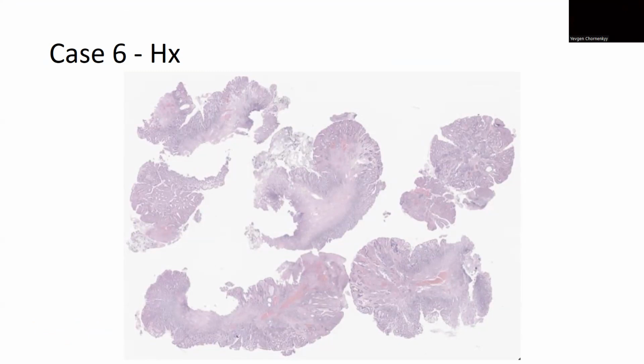I have a question for the resident. If you see columnar epithelium in the upper third of the esophagus, which is not colon, what do you call that? Not Barrett's, it's not Barrett's. It's called a gastric inlet patch. So you can have a patch of columnar mucosa in the upper third of the esophagus. It looks like gastric mucosa.